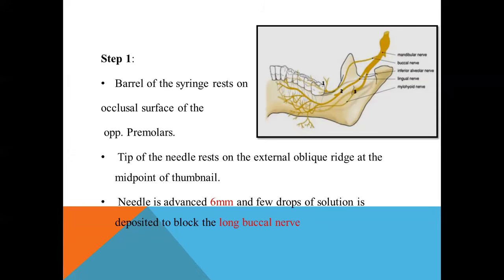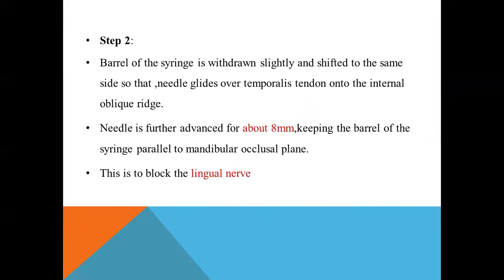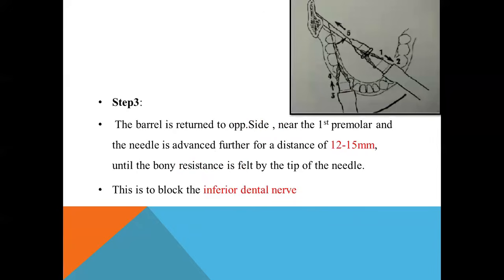In step 1, the needle is advanced 6 mm. In step 2, the needle is advanced a further 8 mm. In step 3, the needle is advanced a further 12 to 15 mm.